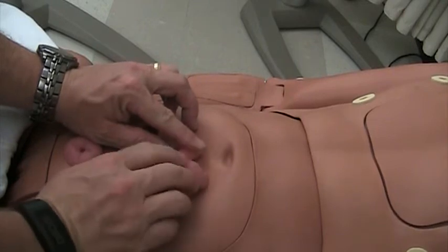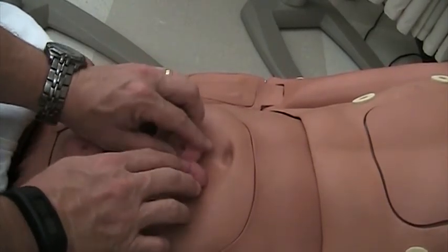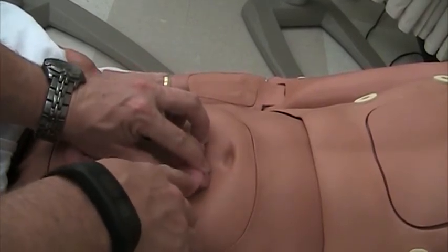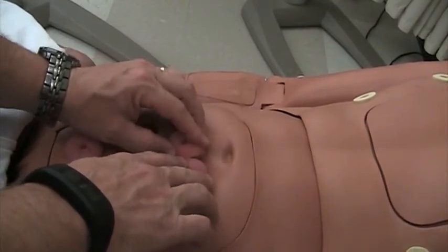Okay, so that stool would come up and drain out of this pouch, but just mucus would be out of this pouch that the body normally makes. It could come out of the pouch and out of the rectum. Okay, but one pouch would cover both of them.